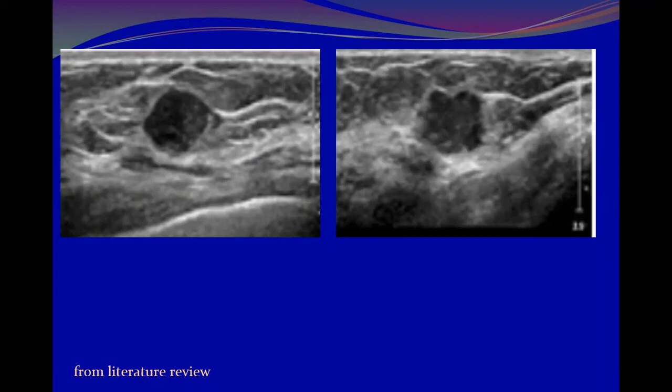And this one is microlobulated, angulated, indistinct. It is an angular margin, yes. And even here, fine spicules can be visualized. This is almost BI-RADS 5. You will give this BI-RADS 4B. It's okay, accept it. 4B, 4A.